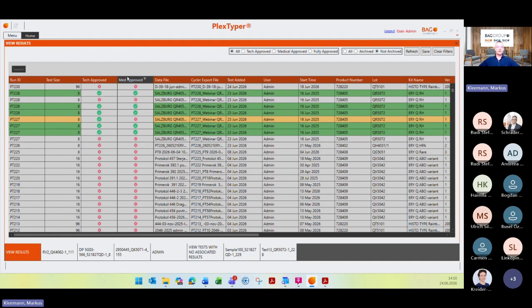Whenever only the medical approval, for example, is missing here, then you see that there is a different color, or when you have the medical and the technical approval not done, then it's this gray one. So that's up to you, this function. You will see also these approvals in the audit trail of your report. So maybe this is an interesting tool for you.